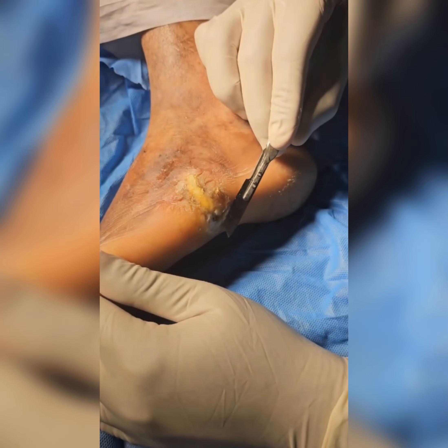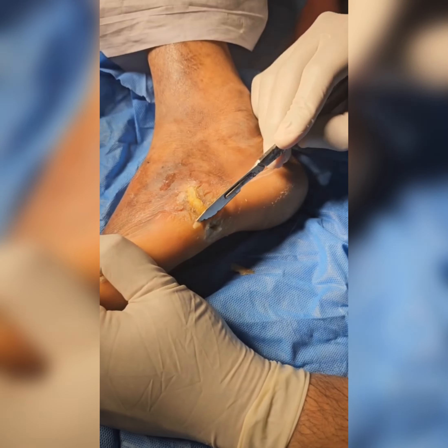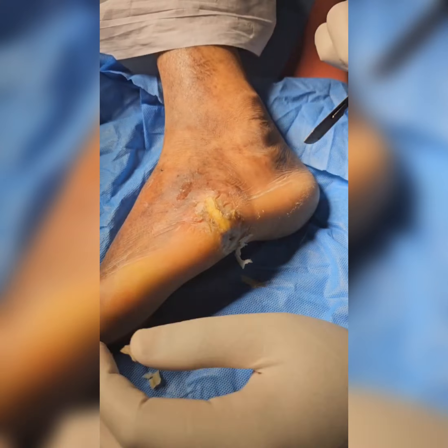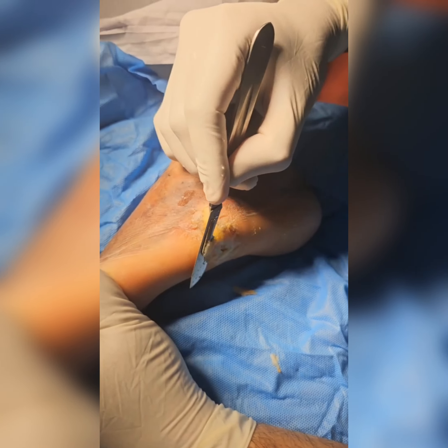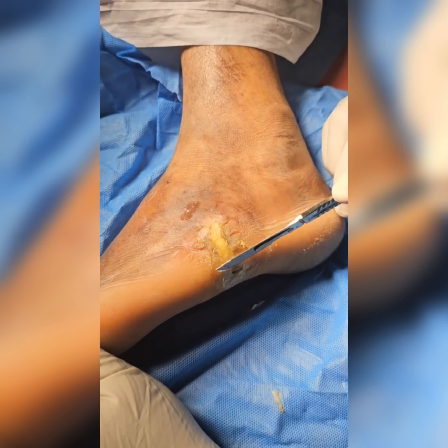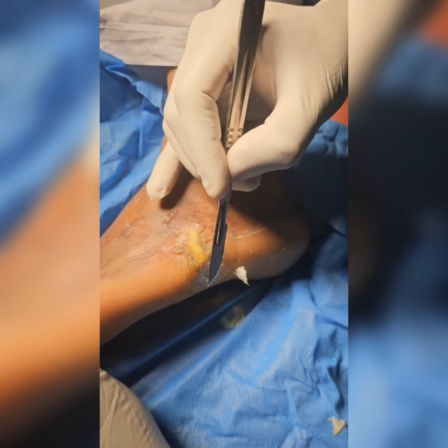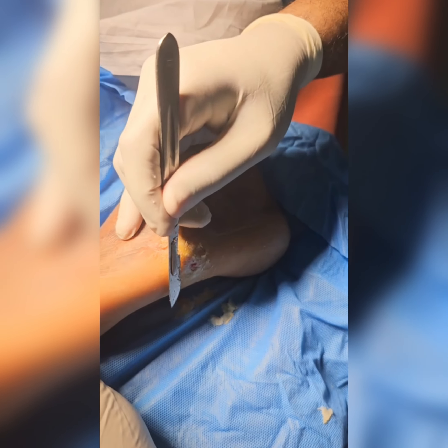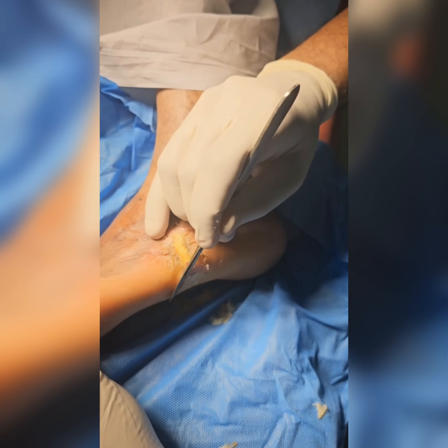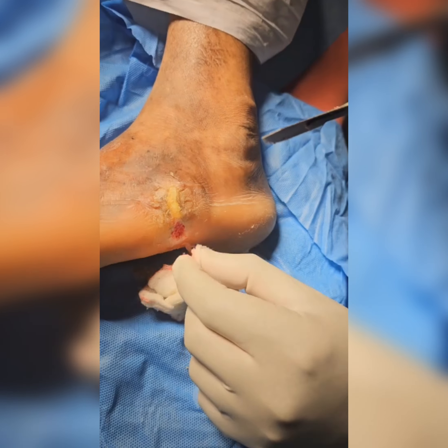Using a 22 blade, you gently scrape the callosities till the wound edges get in alignment with the normal sole of the foot. The procedure should be done under sterile aseptic precaution and gently so that no new injuries or new infection is created in the foot which may hamper its healing.